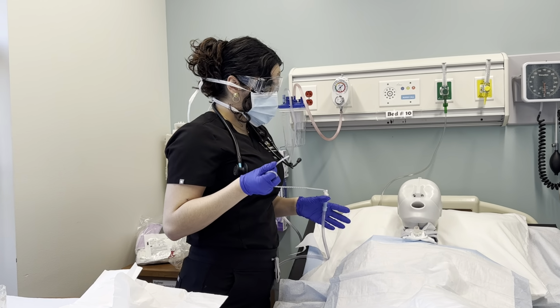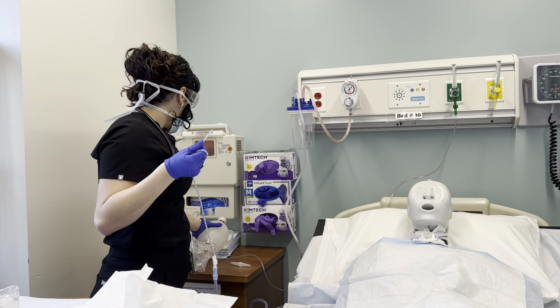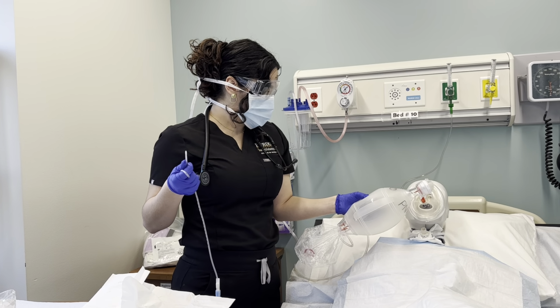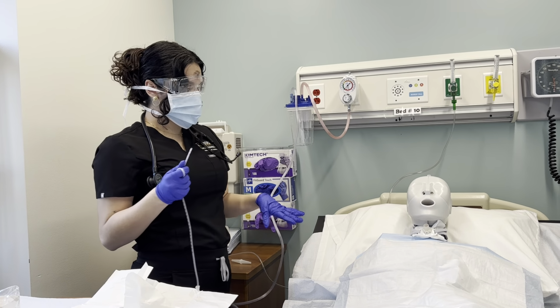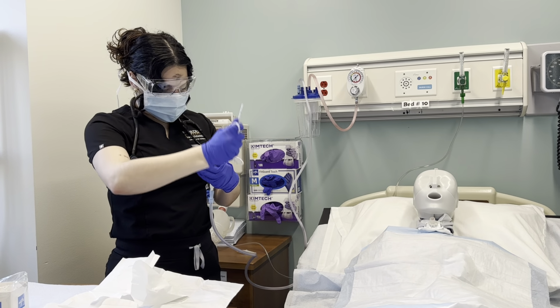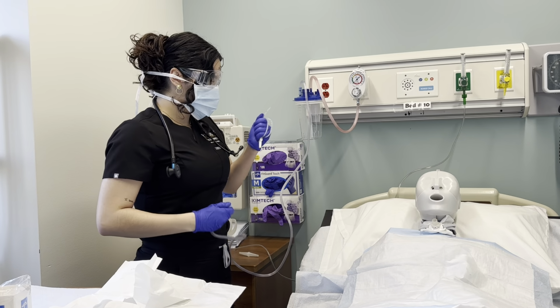I will ask the patient to cough and deeply breathe for me. And then I will administer oxygen. I would do this for up to 3 times, no more than 3 times. And then when I am done, I will wrap the catheter in my gloves, remove it from suctioning.